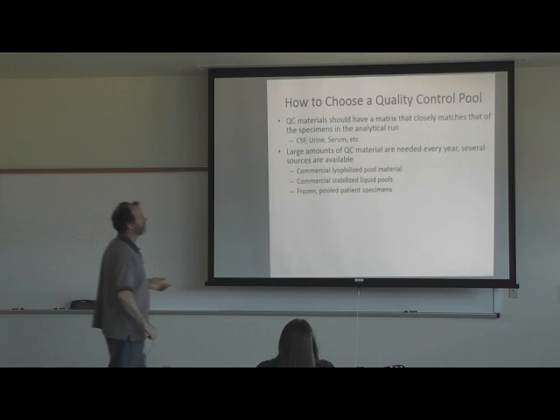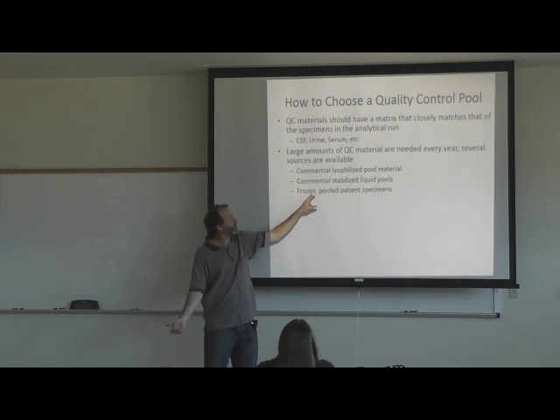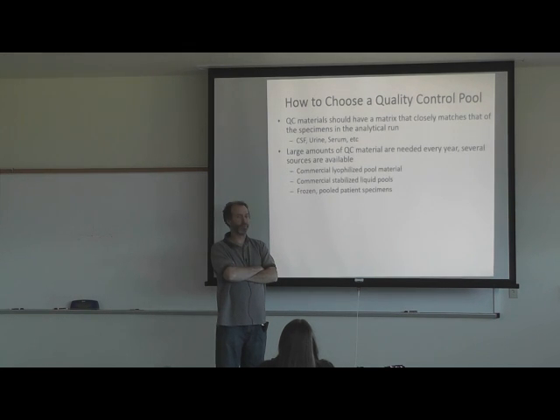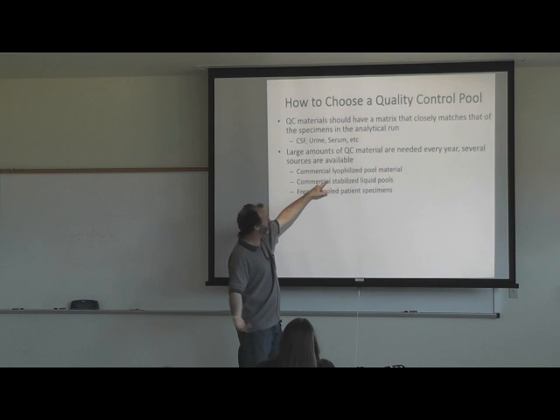Large amount of QC materials needed every year. Several sources are available. Like we already said, there's commercial sources. Commercial lyophilized pool material, commercial stabilized liquid pools, frozen pooled patient specimens also. What does lyophilized mean? Like dry, freeze dried. Yeah, so lyophilized is just freeze dried.